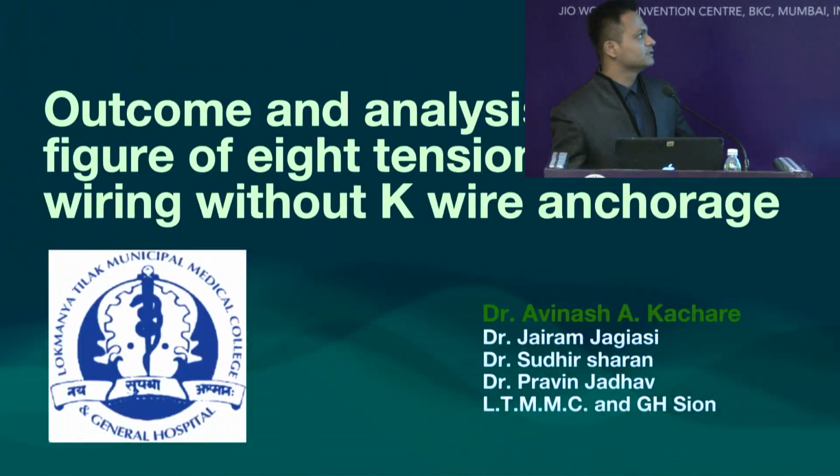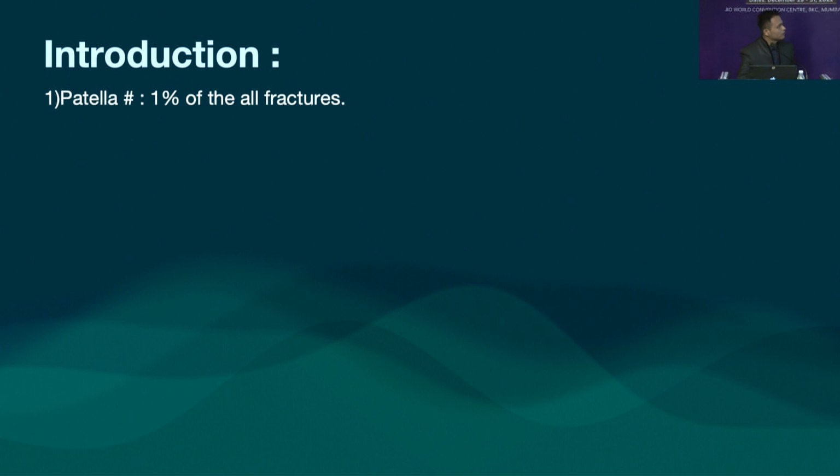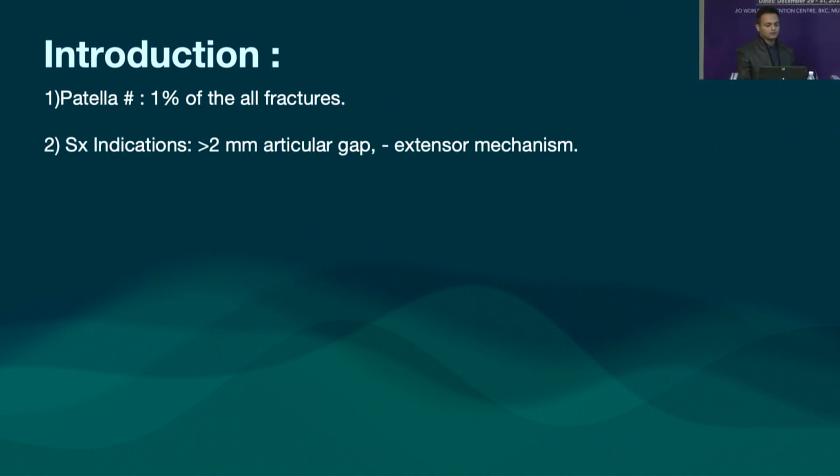Avinash presenting outcome and analysis of patellar fracture fixation using figure of 8 tension band wiring without K-wire anchorage. As we all know, patellar fractures consist of 1% of all fractures, and surgical indications are more than 2 mm of articular gap, and if there is an extensor mechanism disruption.